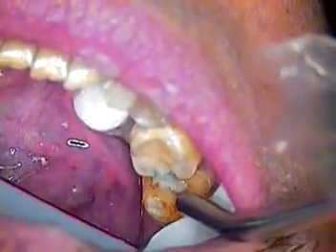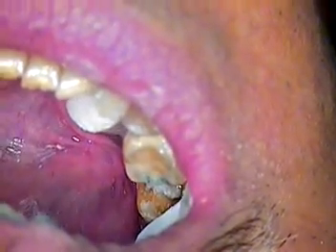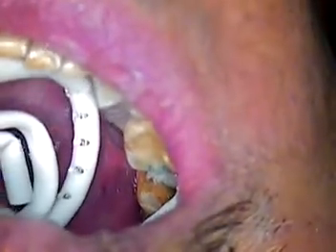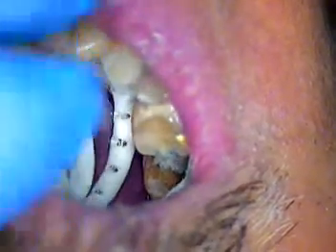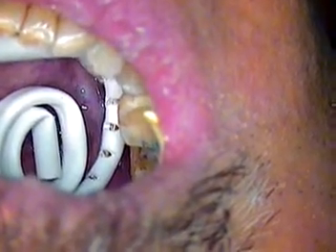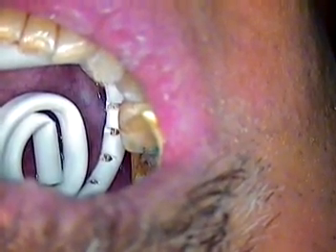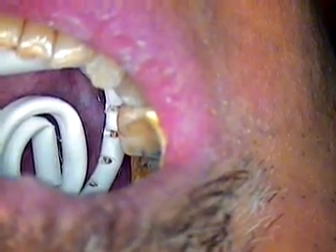Now we're going to place retraction cord and a sublingual saliva ejector to get ready for our impression. Today we're going to use the AquaSyl Ultra XLV — I believe it's called XLV Fast Set. So three minutes: as soon as you mix it, you load it in the mouth, three minutes later, presto, you've got an impression.